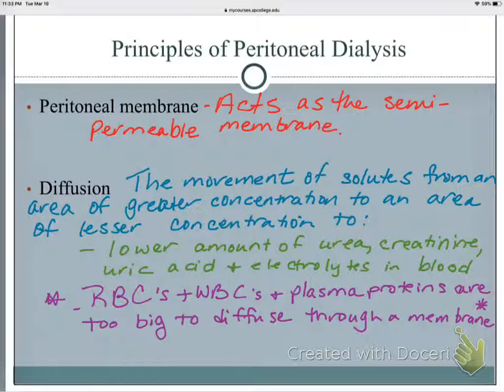Okay. Anybody need more time? Just a dumb question. So, we're not doing anything for RBCs and WBCs. We're just staying inside while we're cleaning everything up. Exactly. Okay. You don't want them to come through the membrane. Otherwise, you'd be very anemic and low protein.